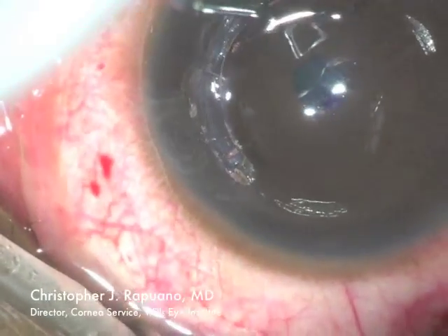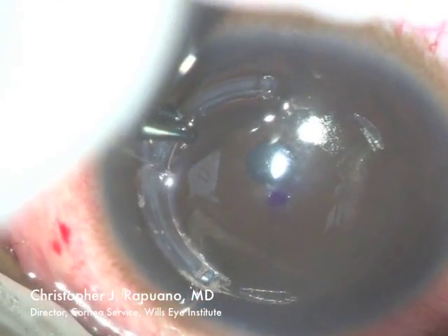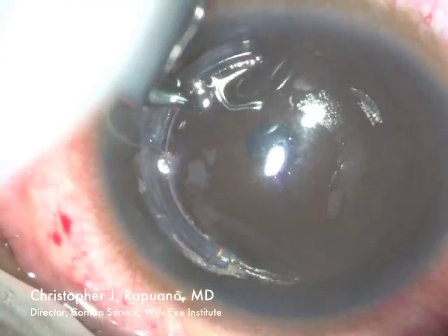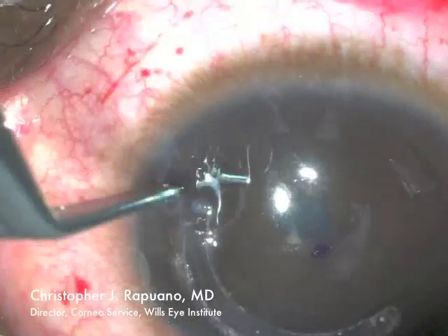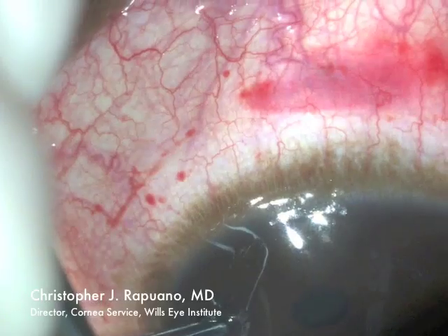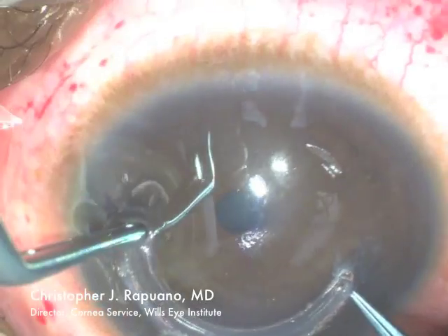The lamellar dissection with the femtosecond laser is done at approximately 65% to 75% depth. It's often tricky to get the intacs segment all the way in because you're pushing it around a circle. Here it's almost all the way.